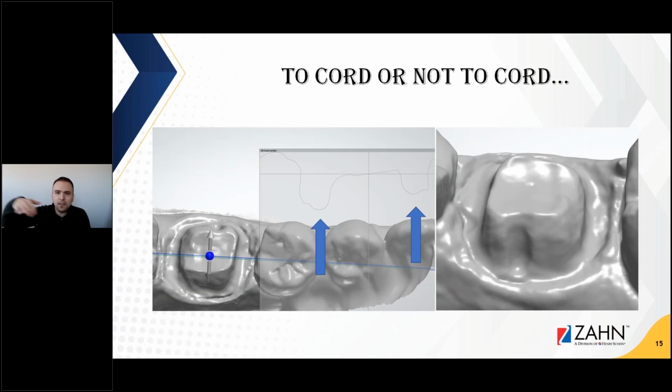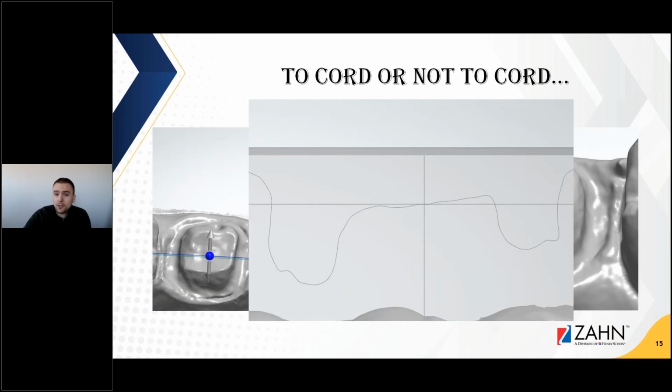It's mostly flat and smooth, and so we don't really know where that margin could be. There's potential spots where the margin could be. So it could be up there, down there, a little further out, a little further in. So it really becomes a challenge to figure out where their margin is.